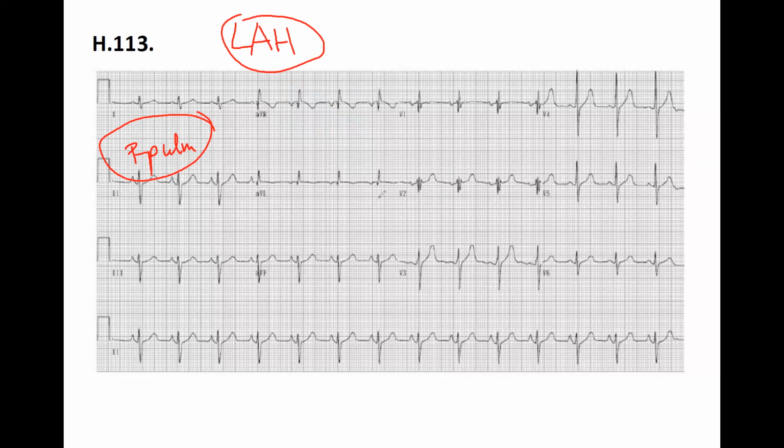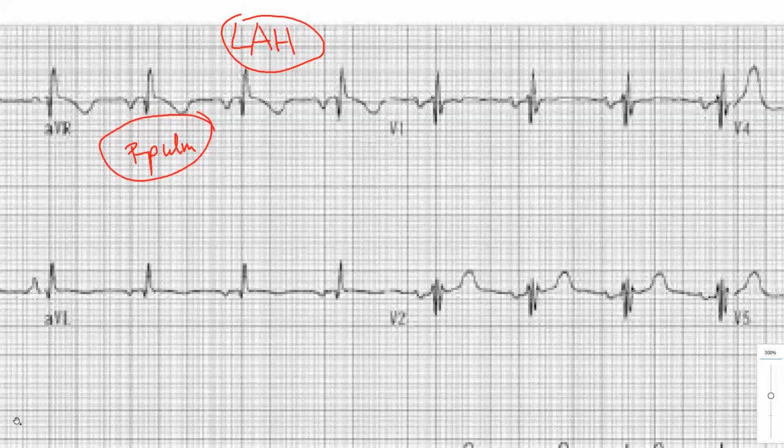Pathological Q waves. Well, let's see. There's somewhat of a Q wave in AVR, but that doesn't count, I think you said. So we will look at the precordials. It's difficult to see with the quality. It sort of looks like V1. I will draw you, especially in V1. We like V1 very much. Oh, so it's an RSR there.